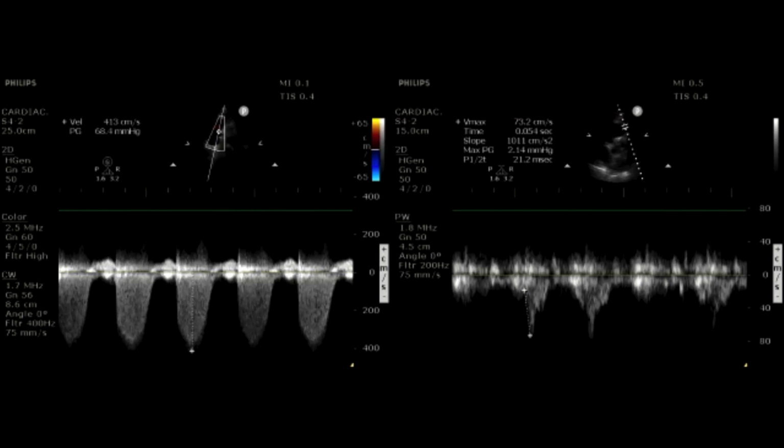The other question that came up in the chat here from the MICU is in regards to intubation, right? So how does the fact that someone may be intubated and now on positive pressure ventilation, where we decrease the ability for the thoracic pump to work, right, and the effects that it has on the right atrial pressure, how does intubation affect our ability to perform this test? So intubation in terms of how the echo images are acquired, or how to interpret the data? Does the intubation have an effect on the physiologic findings that we're seeing here?